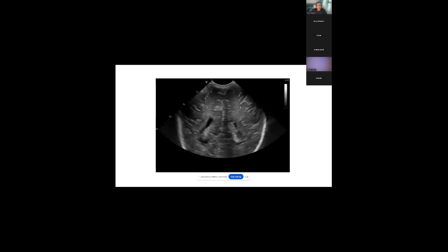And I didn't take a view of, after I had saved the things, I realised I hadn't taken a full view of the orbital. No problems. No problems. Okay.